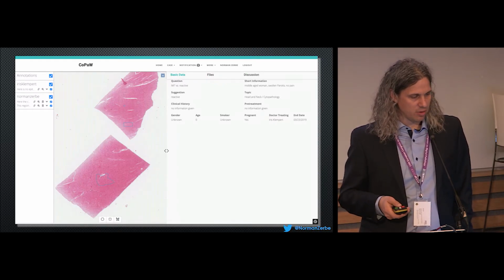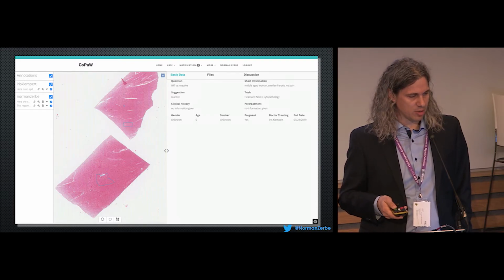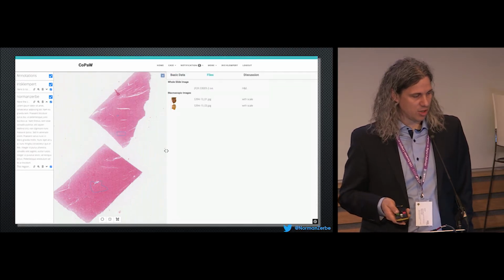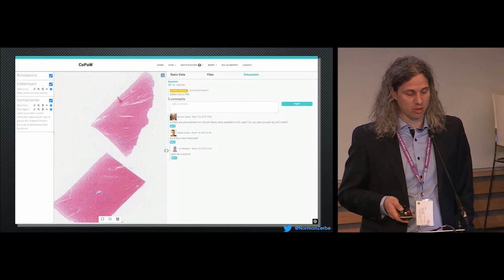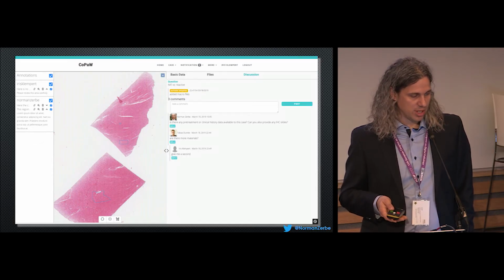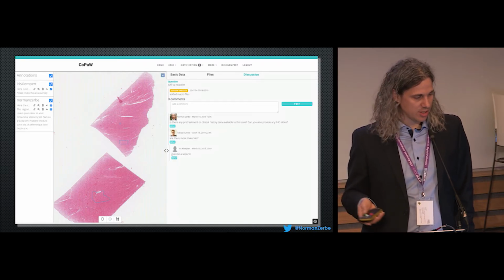So you have a side-by-side view of the image data on the left, and of all the textual and metadata on the right side. Here you have different tabs on the right side: the basic data which we saw in the first form, the files attached to that case, and you also have the possibility to discuss interactively, in a thread-based manner, the questions that are arising or the recommendations that are given by other authors. And you can of course also add annotations, as I said, to that case.